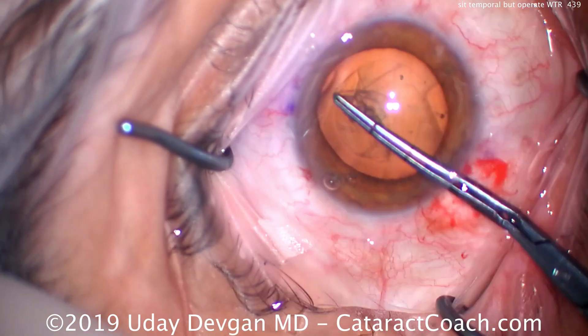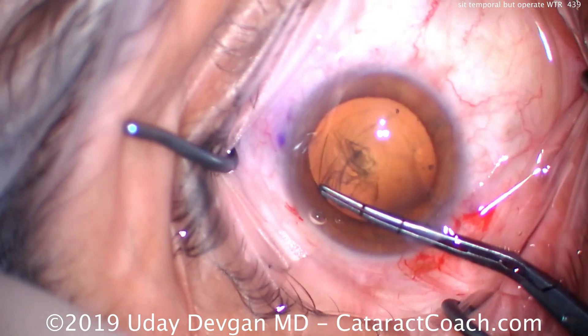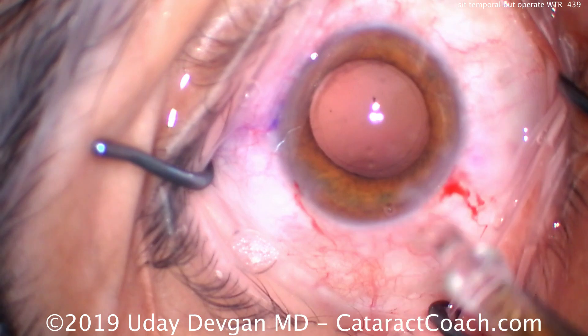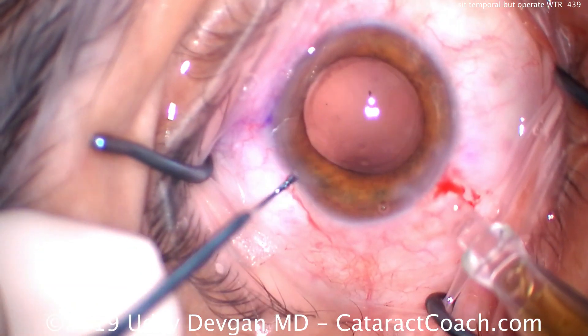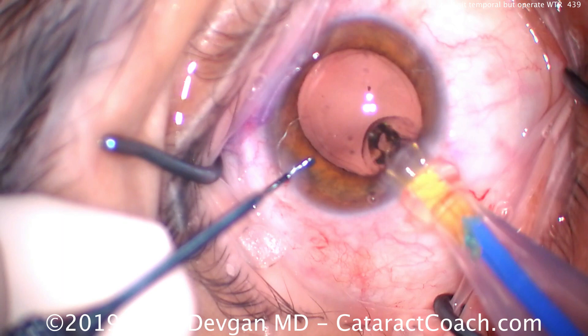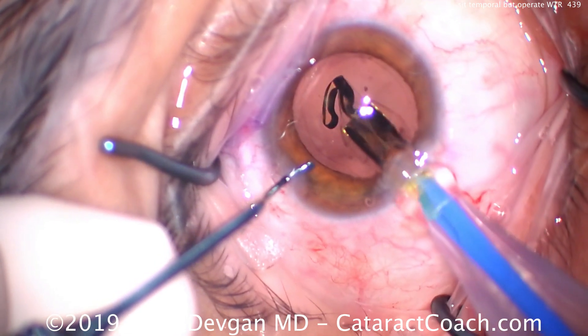These two paired incisions will cause about 0.75 to one diopter of flattening at that meridian. This is a very simple and easy way of fixing the patient's pre-existing corneal astigmatism. Here's the end of the case — it went routinely, everything went great.